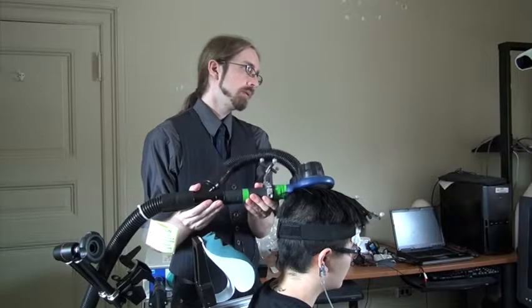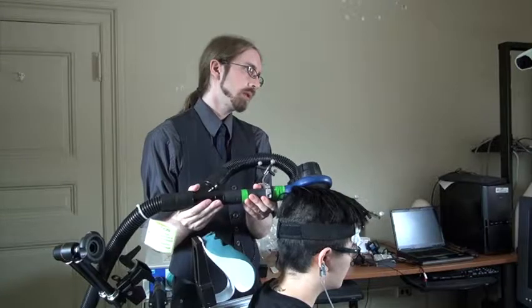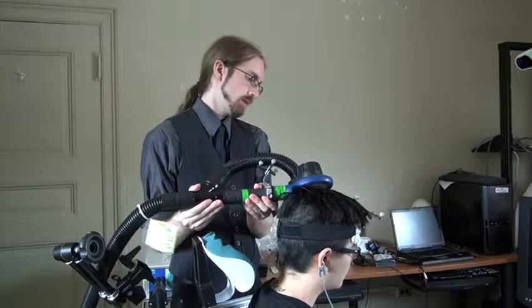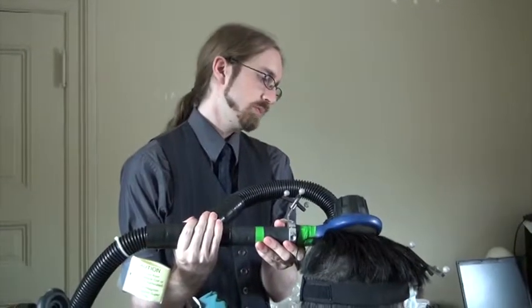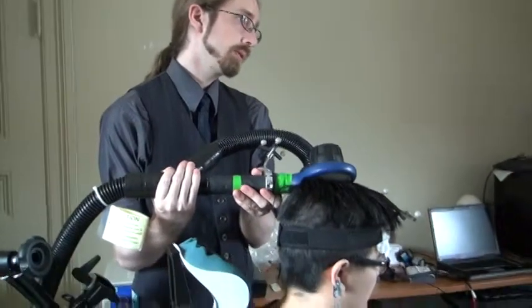Transcranial magnetic stimulation, or TMS, is a non-invasive brain stimulation technique that uses a rapidly changing magnetic field to induce weak electrical currents within specific brain areas.